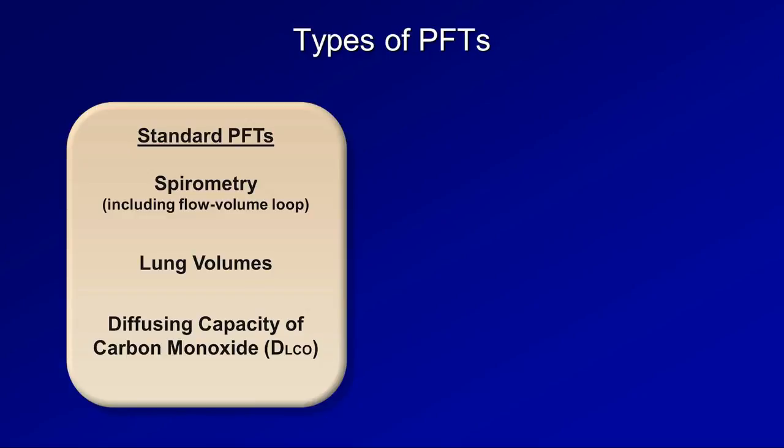In the absolutely most general sense, spirometry is responsible for diagnosing obstructive lung disease, lung volumes are responsible for diagnosing restrictive lung disease, and the DLCO, in conjunction with other tests, is responsible for suggesting the possibility of pulmonary vascular disease.